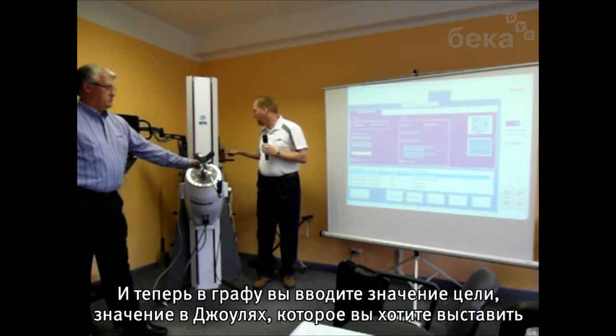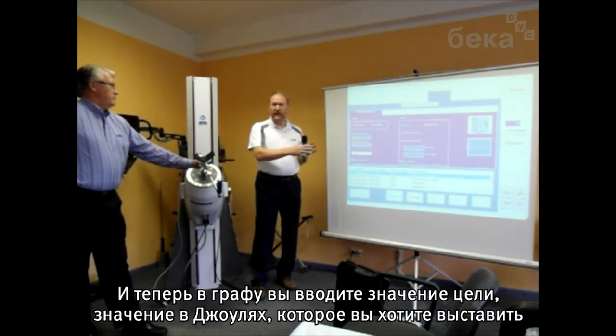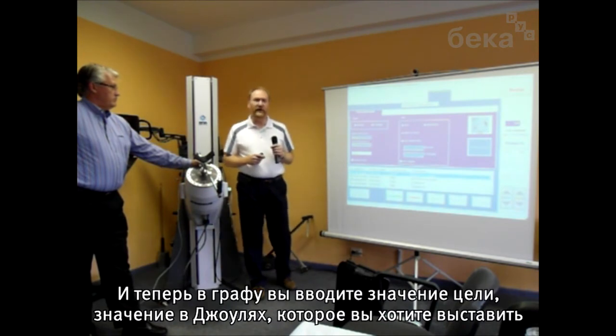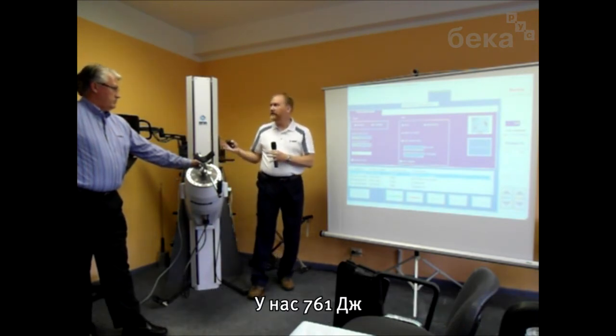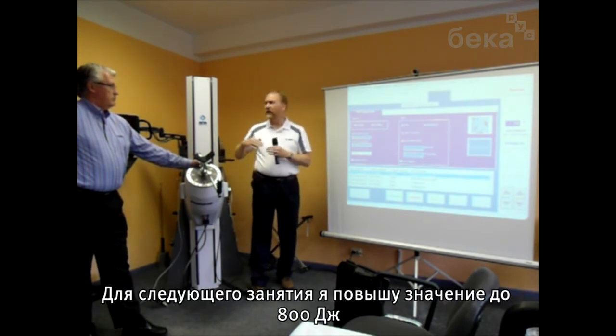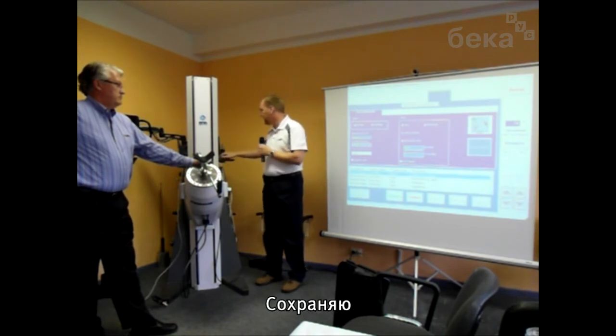And then in the box where you're designating the goal, you can put in the number of joules that you want that person to achieve during the next exercise. Now his result was 761. What I would probably do for this person for the next time is just round that up to 800. So I'm going to go ahead and save this.